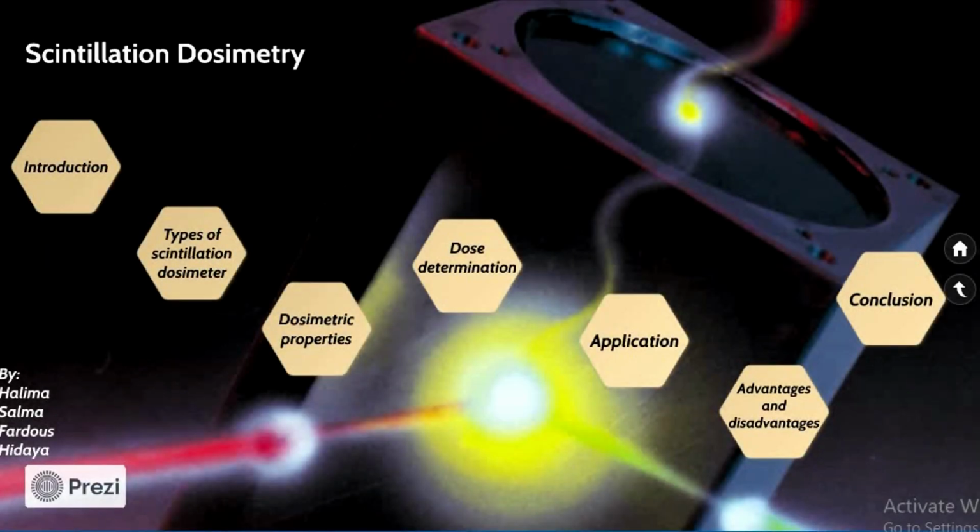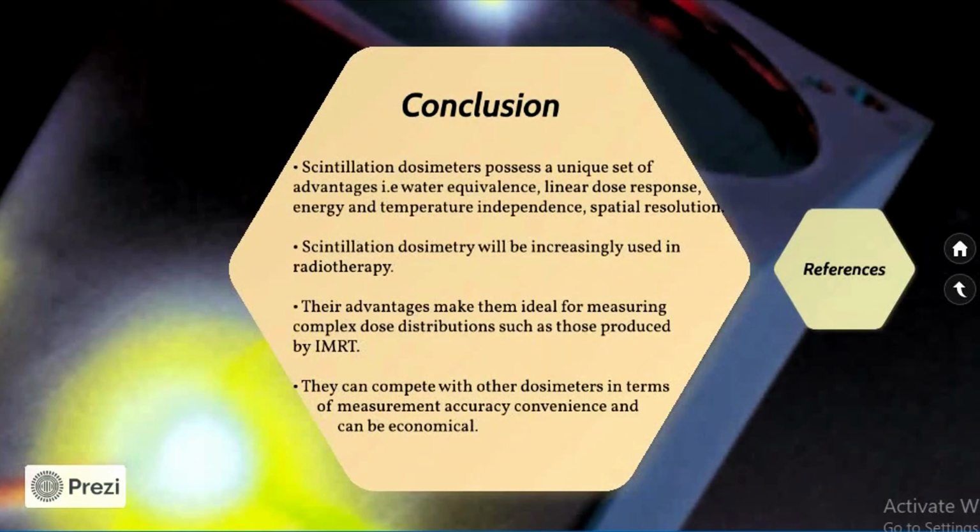To sum up, several types of scintillation detectors have been developed in the last 15 years. Scintillation dosimeters possess a unique set of advantages like water equivalence, linear dose response, energy and temperature independence, and spatial resolution. Scintillation dosimetry will be increasingly used in radiotherapy.